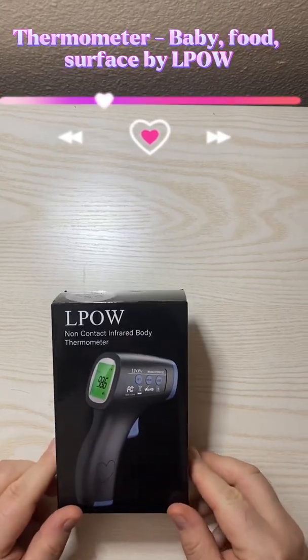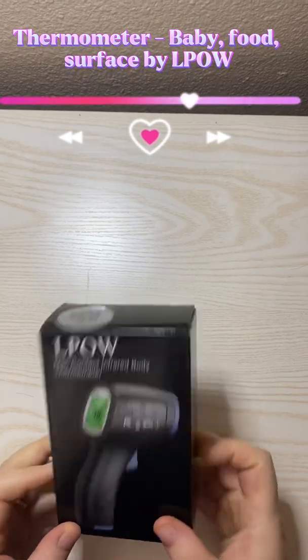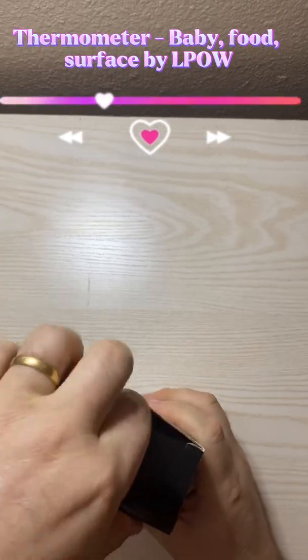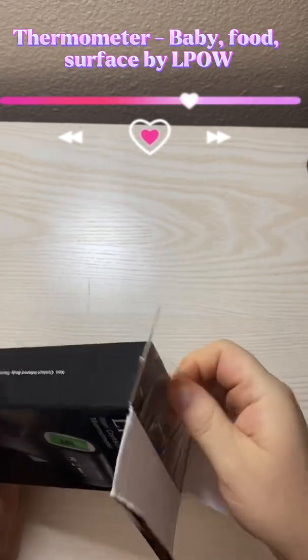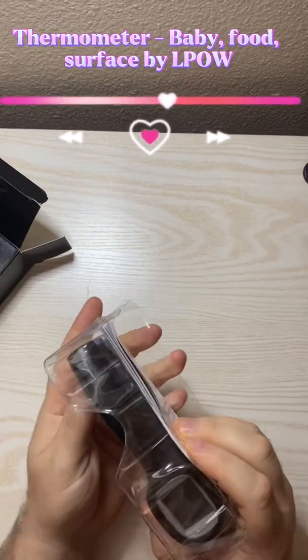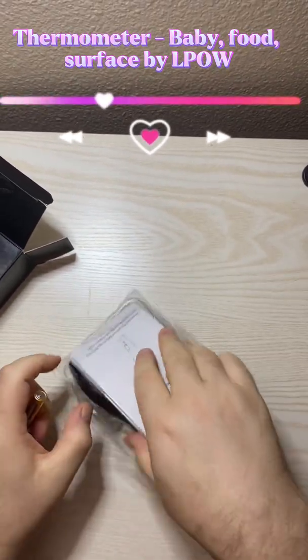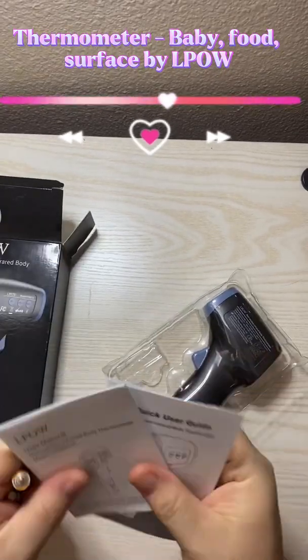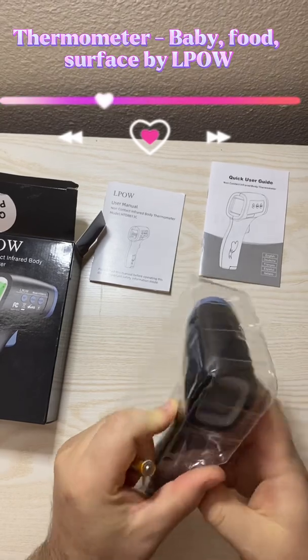Today we're talking about how to use the LPOW non-contact body thermometer. I'm going to go ahead and open it up. It comes with two batteries and an instruction manual as well.